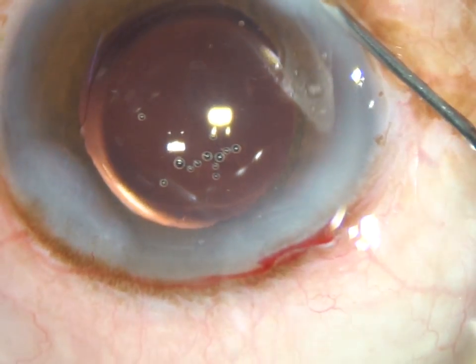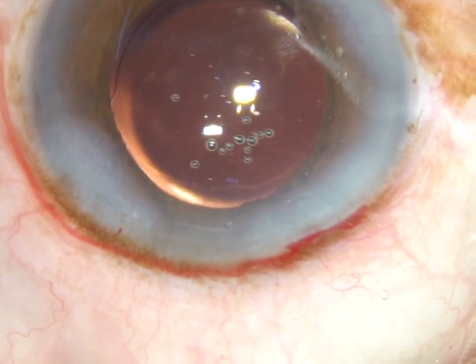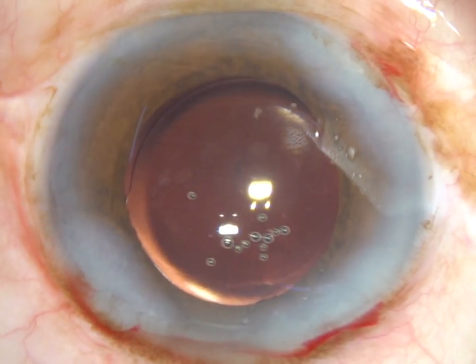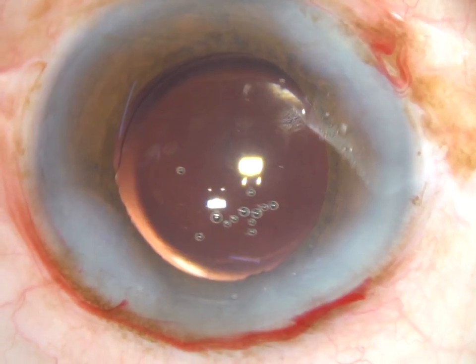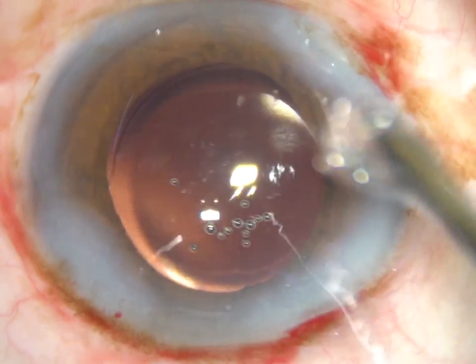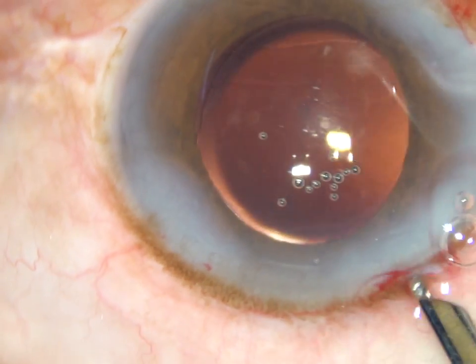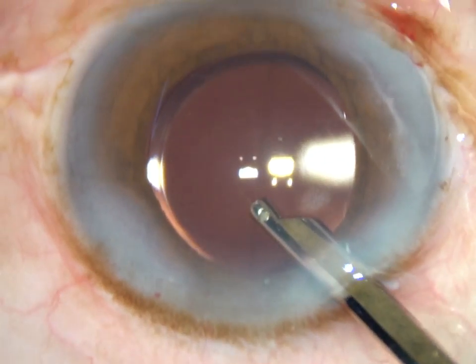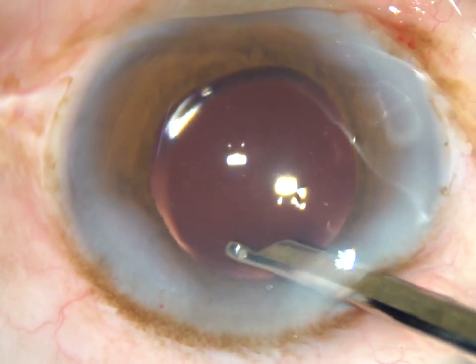The side ports on the left and right — both are closed by corneal stromal hydration. And now this is the final lavage of the anterior chamber. BSS is taken in a 10 cc syringe and the BSS is irrigated through the aspirating port.